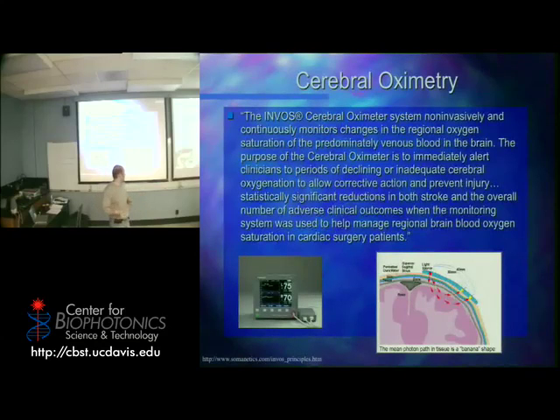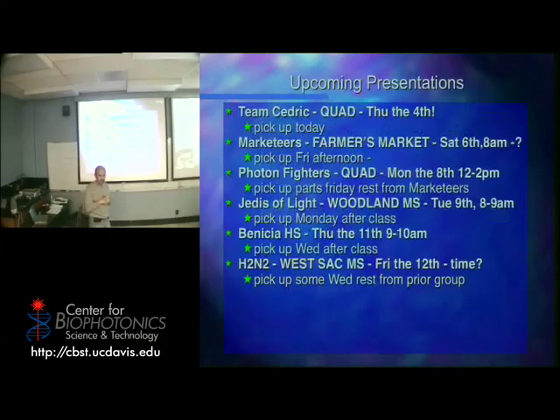And the way that one works, the neonatal one, is just literally a little pad that you stick on one side of the brain, stick on the other side of the brain, and you see if there's any kind of motion of blood which indicates activity. Much easier than an MRI or an fMRI, and shows you activity right away. Okay? Questions about that? So, with that, that's it for pulse oximetry. Okay? Any questions in general?